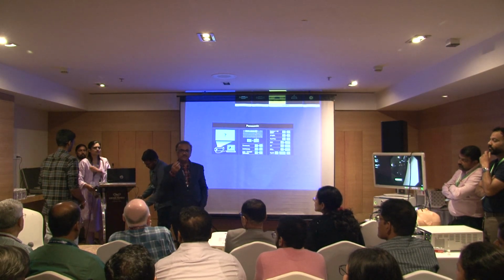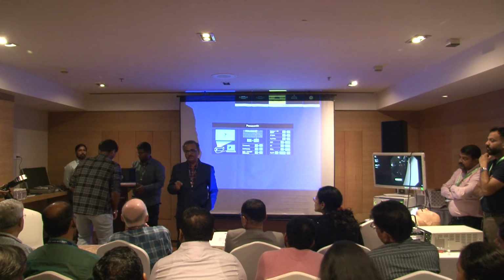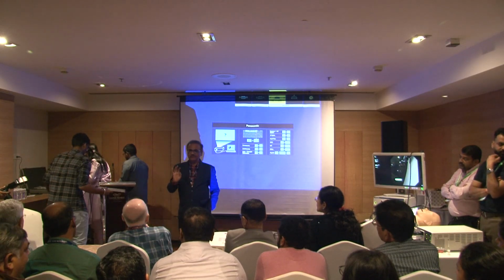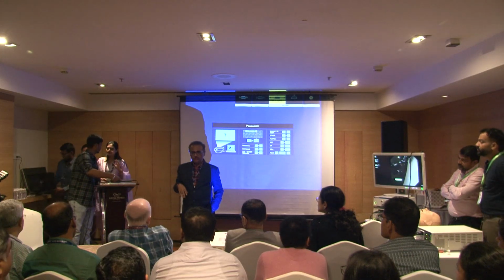First thing is, once you understand there is granulation, you prepare your mind that your anesthesia is going to extend, your time is going to extend, and at that time don't be in a hurry. Ask the anesthetist to take 10, 20 minutes more.